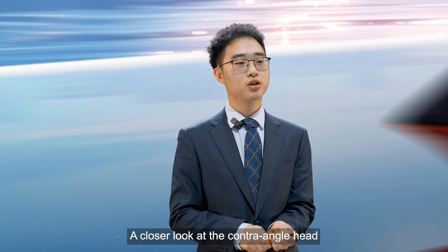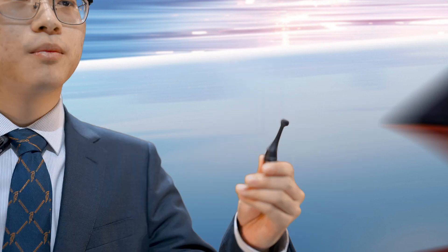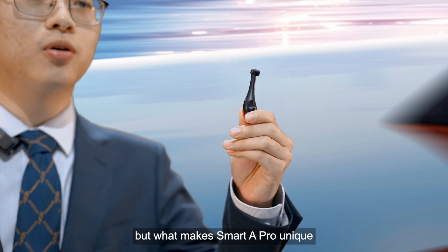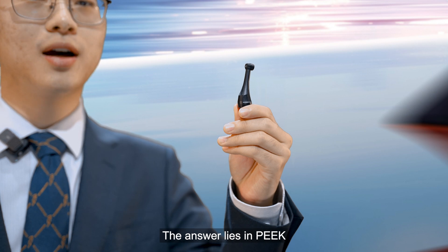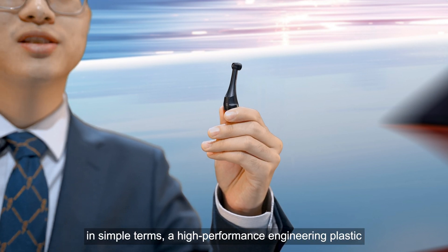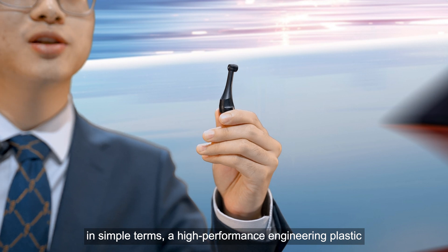A closer look at the contra-angle head. Most 6:1 contra-angles may seem similar, but what makes Smart A Pro unique? The answer lies in PEEK — a semi-crystalline thermoplastic polymer, or in simple terms, a high-performance engineering plastic.